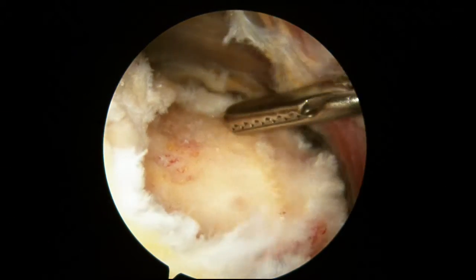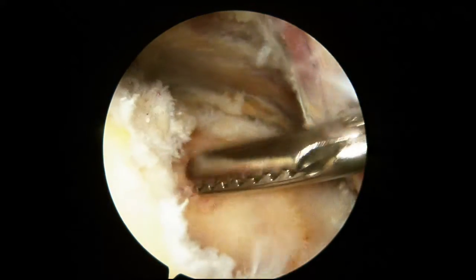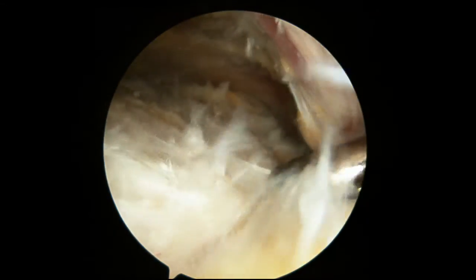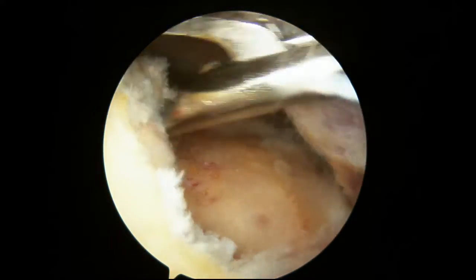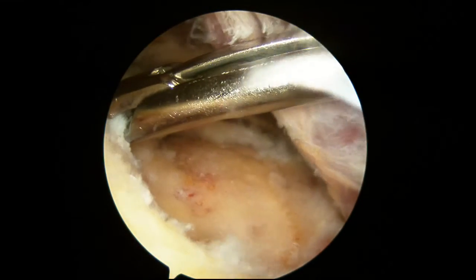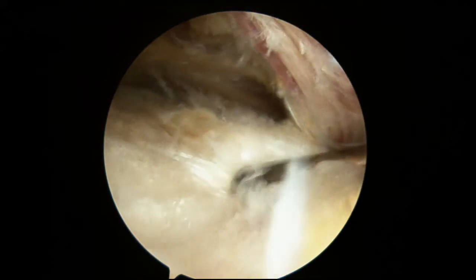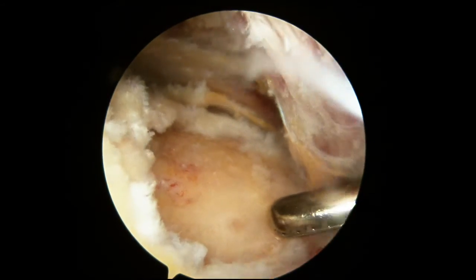Here I'm touching and pointing to that greater tuberosity — that exposed bone — which is the edge where the tendon should come all the way back to. Now I grab the tendon and I'm able to pull it back. You see I'm able to pull it, and then it snaps back — that's because the rotator cuff, just like a rubber band, pulls it back. We use our instrument to see how mobile and easily we can bring the tendon. In this case we can do it pretty easily.